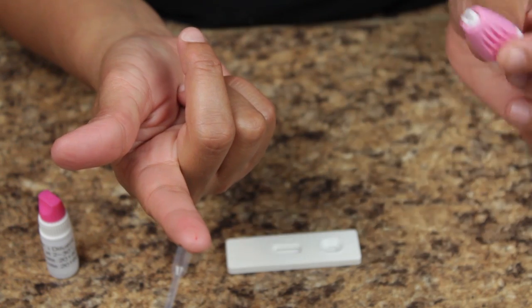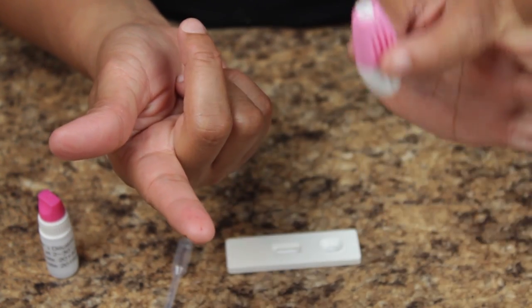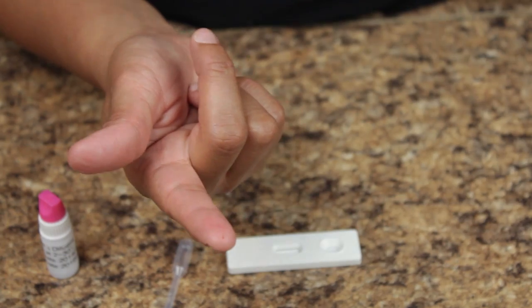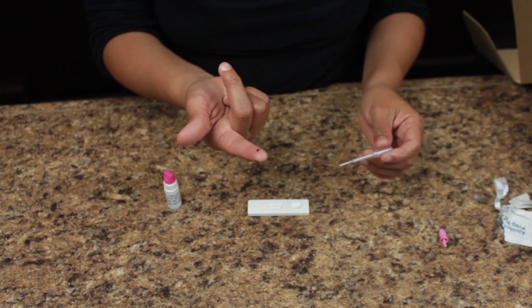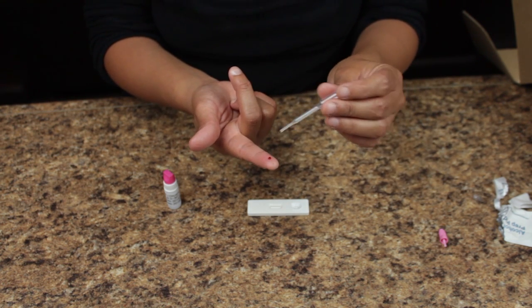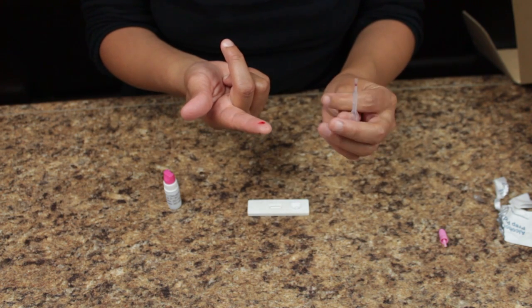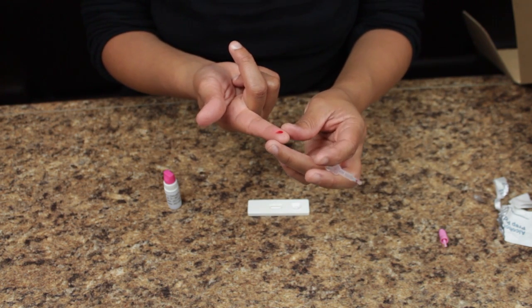The lancet will then prick the finger like so. Dispose of the lancet with care as it could be infective. Using the micropipette, gather a drop of blood from the finger. You may need to squeeze your finger several times to produce enough for the sample.